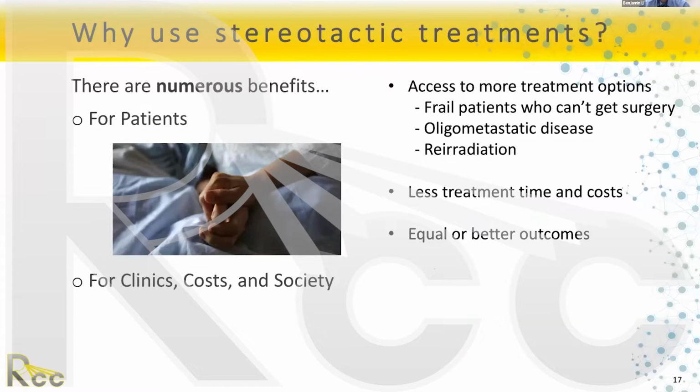So, why are we even taking the risk to do such high dose treatments with a stereotactic technique? Well, let me tell you that if you can perfect this technique, it opens up a world of possibilities. There are numerous benefits for patients, for clinics, for costs, and for society, and it'll allow patients to access more treatment options.